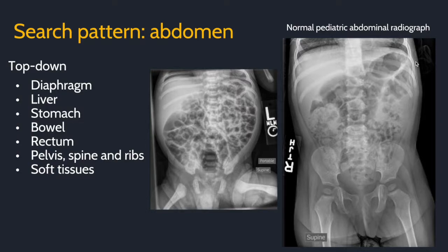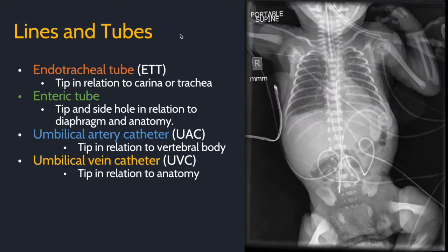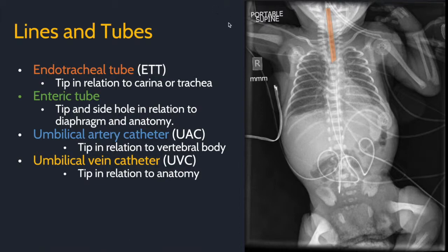This is a normal pediatric abdominal radiograph, and this is a three-week-old infant abdominal radiograph with multiple non-dilated loops of air-filled bowel. Here are the four most common tubes and lines in pediatric radiology. Take a look at this radiograph and see if you can spot them. In orange is the endotracheal tube — describe where the tip is in relation to the carina and the trachea. Here it would be maybe two or three centimeters above the carina in the mid-thoracic trachea.